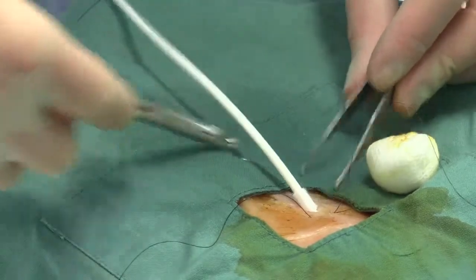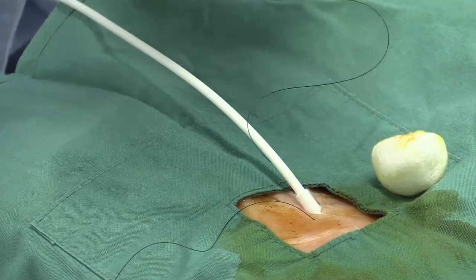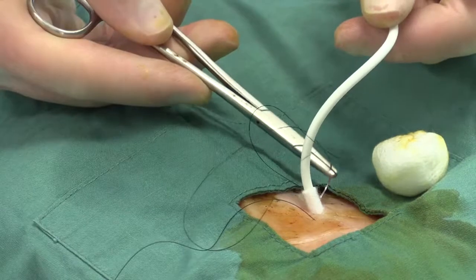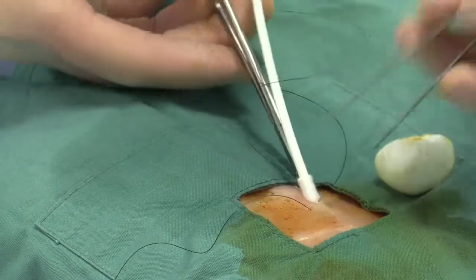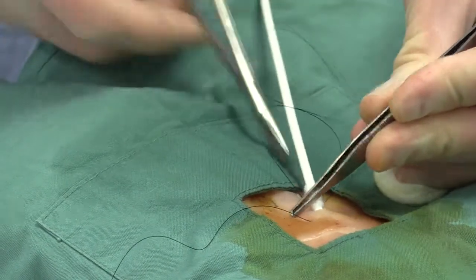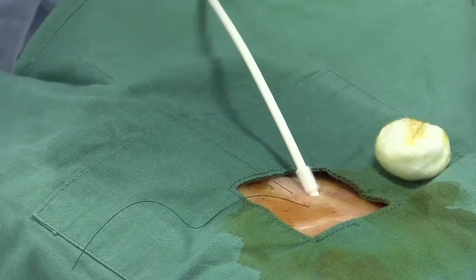So essentially this purse string looks like a box stitch. The trick with this box stitch is not to make it too tight that it causes necrosis of the skin and subcutaneous tissue around the catheter, but is sufficiently snug to add to its watertight seal.